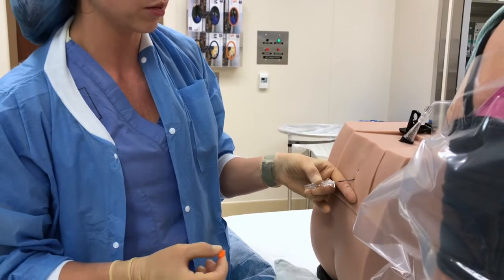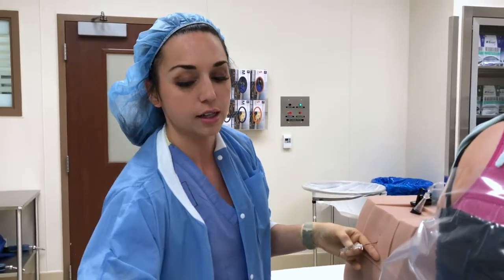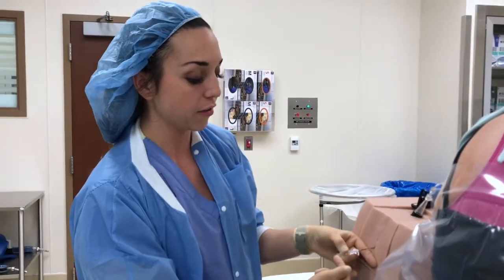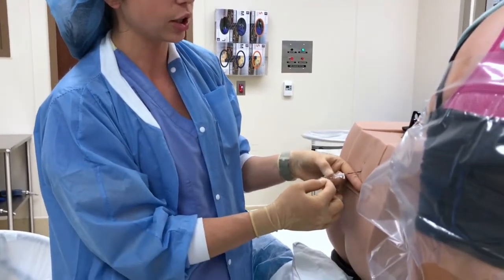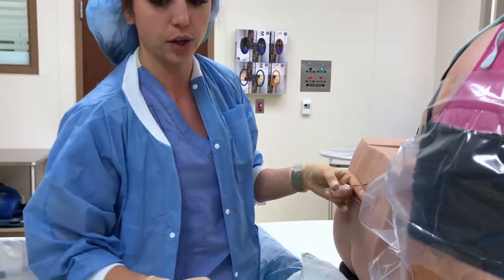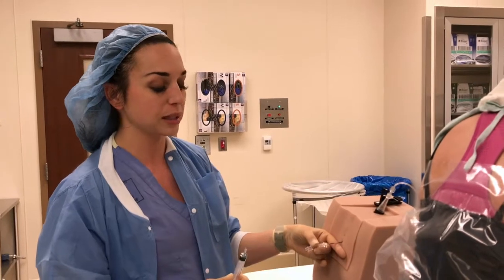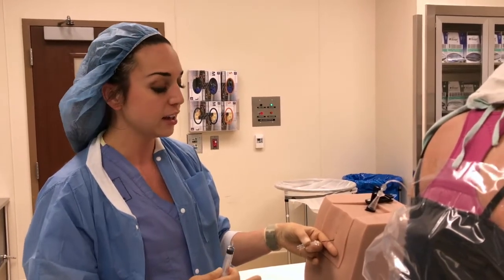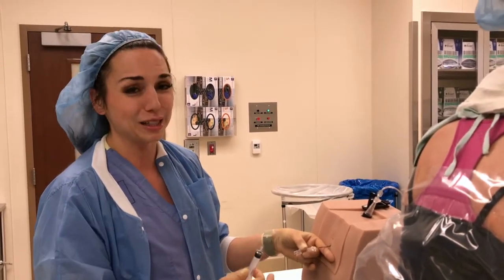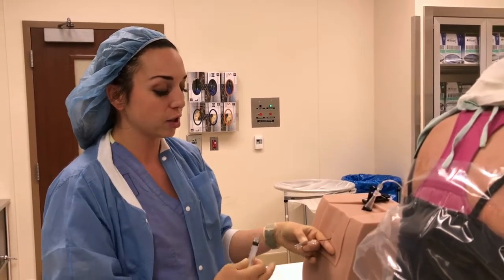Now in this mannequin, we're not seeing CSF, but you should have a nice free flow of CSF backwards. And I basically wait until it's almost dripping out to make sure that you have adequate CSF flow, while keeping all of your components in perfect position, because the spinal space can be kind of finicky, and if you make any sudden movements at this part, you could unfortunately undo all the hard work that you did. So keep everything very, very still.